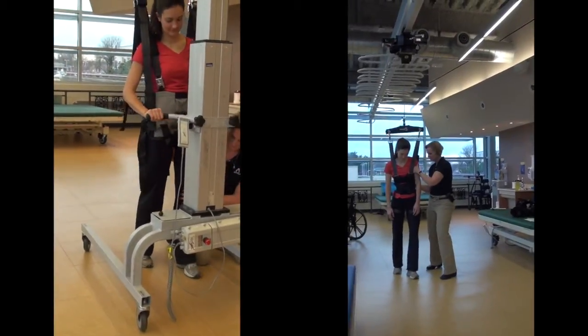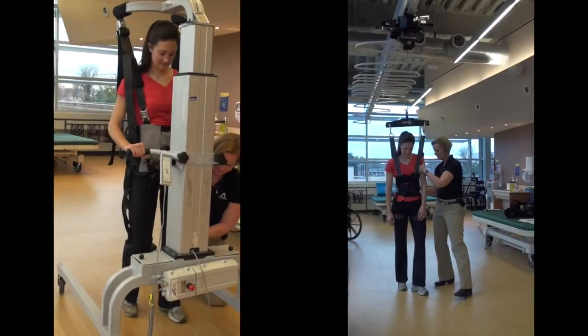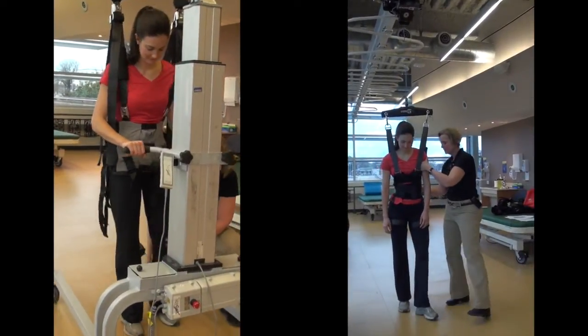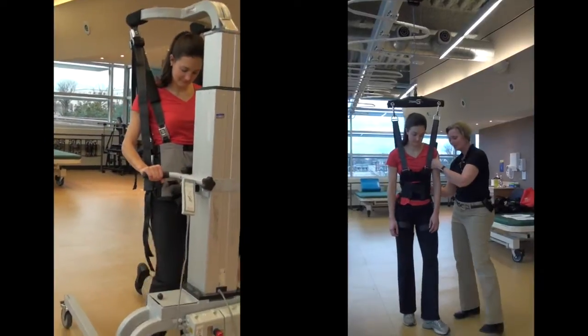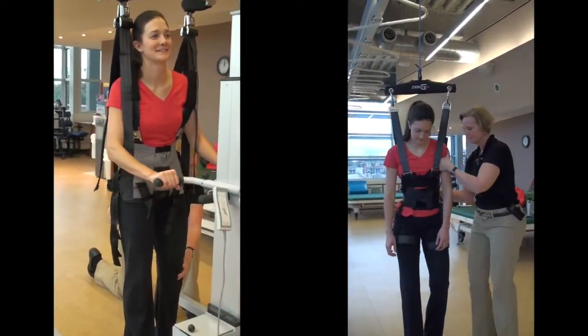The Zero-G Gait and Balance Training System differs from a mobility frame for gait and balance training. A mobility frame is used for fall prevention and walking over ground, but can be cumbersome for the patient and therapist to push along the floor.